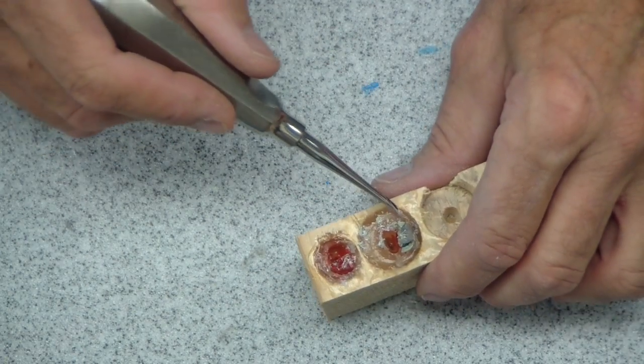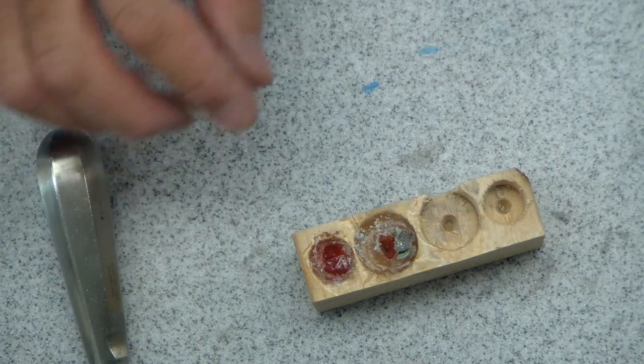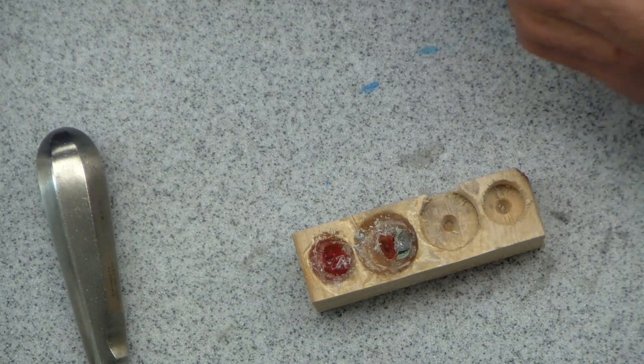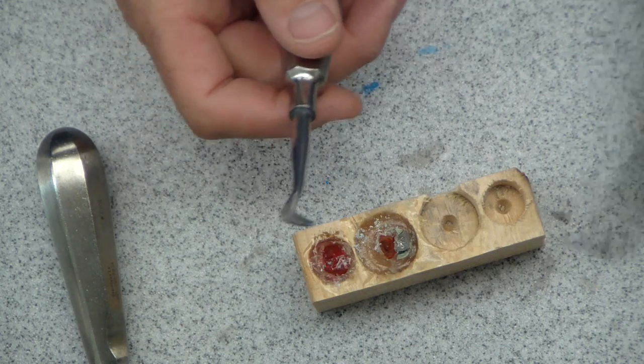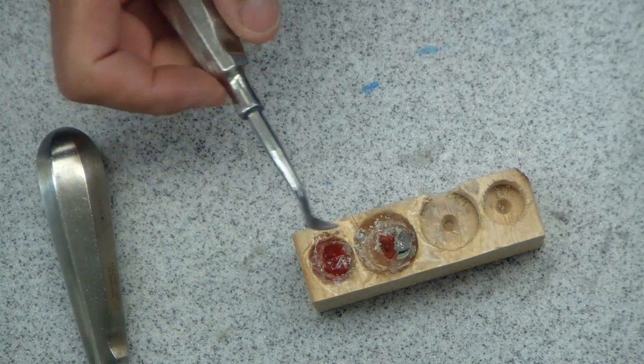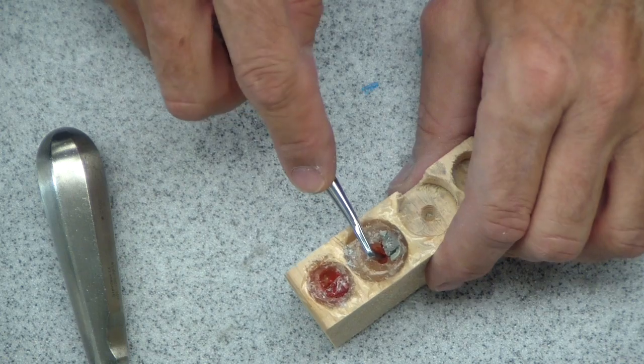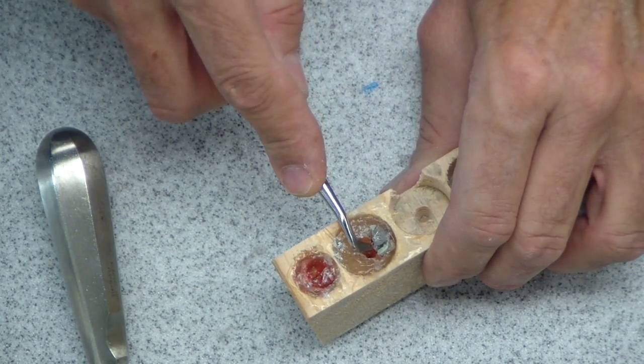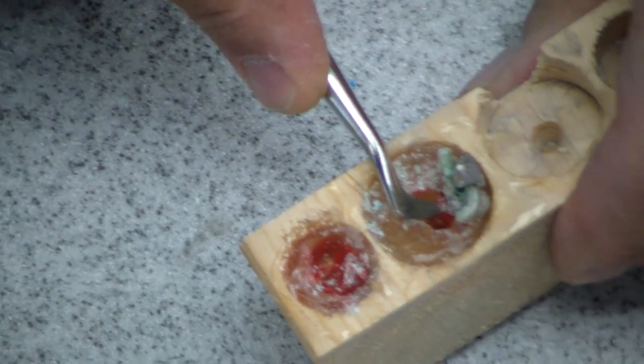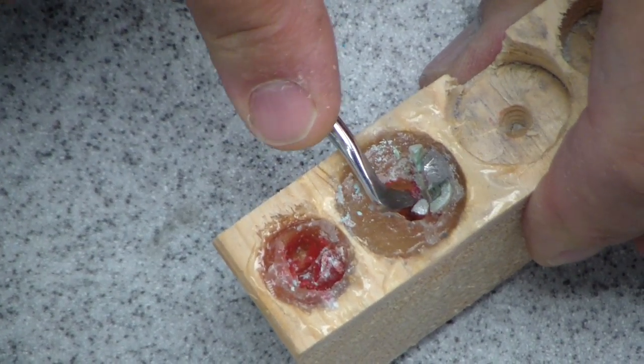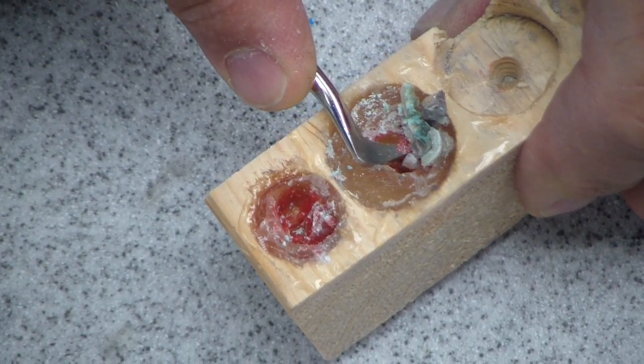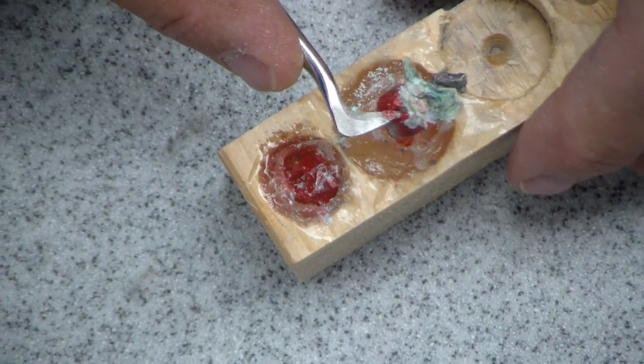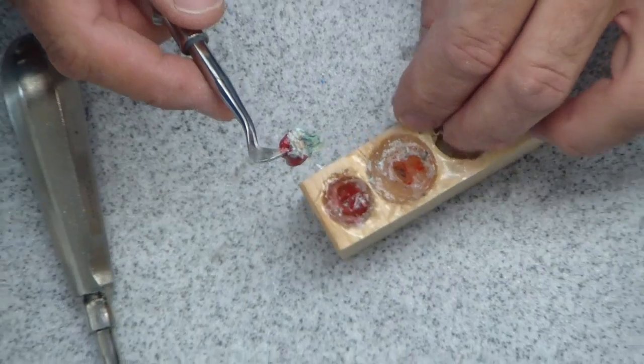I think this other crown may have broken off. We'll see here when I was working on it. So we may get to use our crier. Actually, I can just go ahead and demonstrate how we would use the crier. There are two criers, as I said, both right and left. Some call them east-west. And you just go in through the opposing empty socket. And you can actually go through some of the inter-radicular bone sometimes. Engage that lower root tip. And it's coming out in pieces, but it's coming out there.